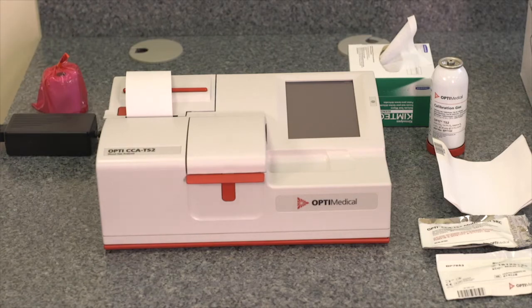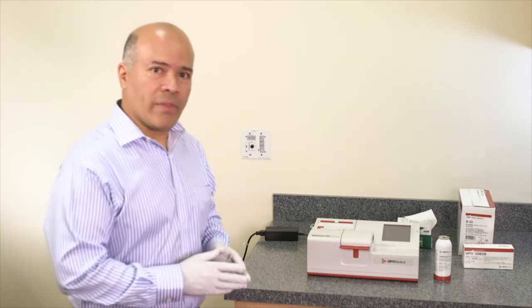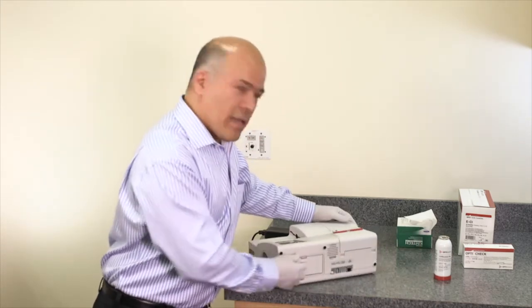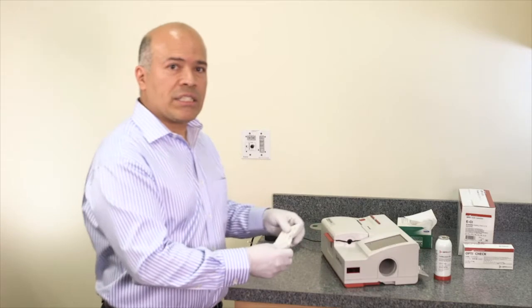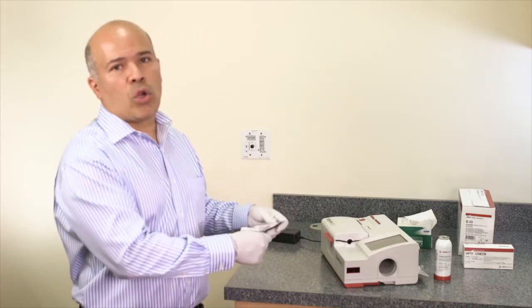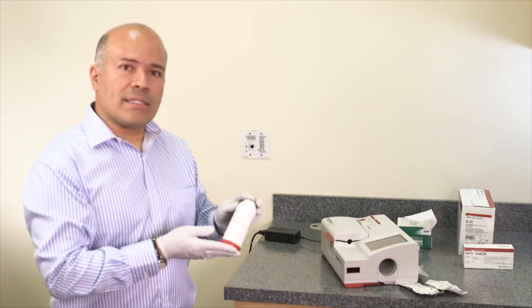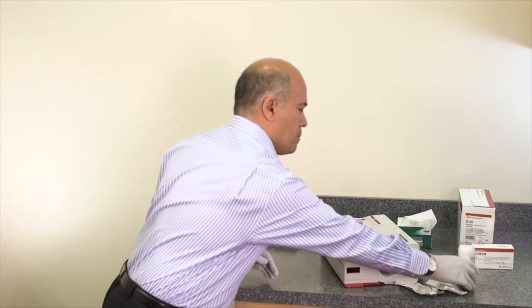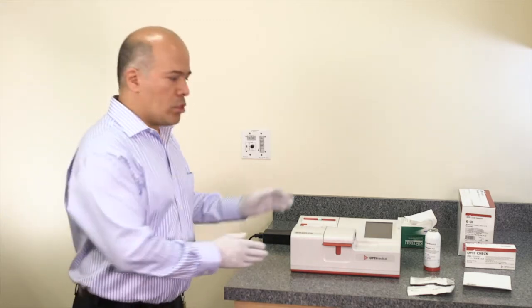With the paper installed, the OptiCCA-TS2 analyzer comes with two cassettes — the multi-level SRC cassette and the total hemoglobin calibrator cassette — located in the cassette compartment at the back of the analyzer. The Opti analyzer also needs a gas bottle to calibrate the cassette. To turn the analyzer on, press the red button located on the side.